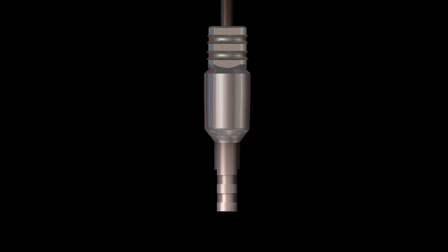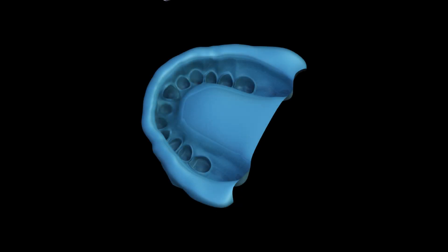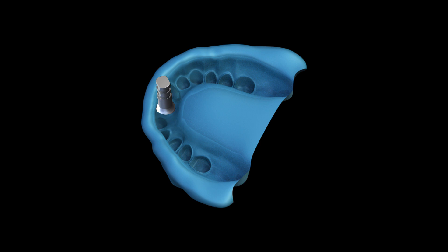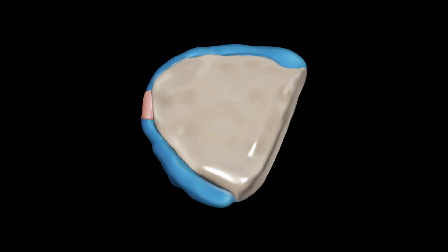Attach the multi-purpose abutment to an analog. Orient the multi-purpose abutment analog assembly so that the flat surfaces of the transfer matches the flat surfaces in the impression, and then fully insert into the impression. Inject pink soft tissue model material around the analog, pour model stone in the impression, and a model is made.